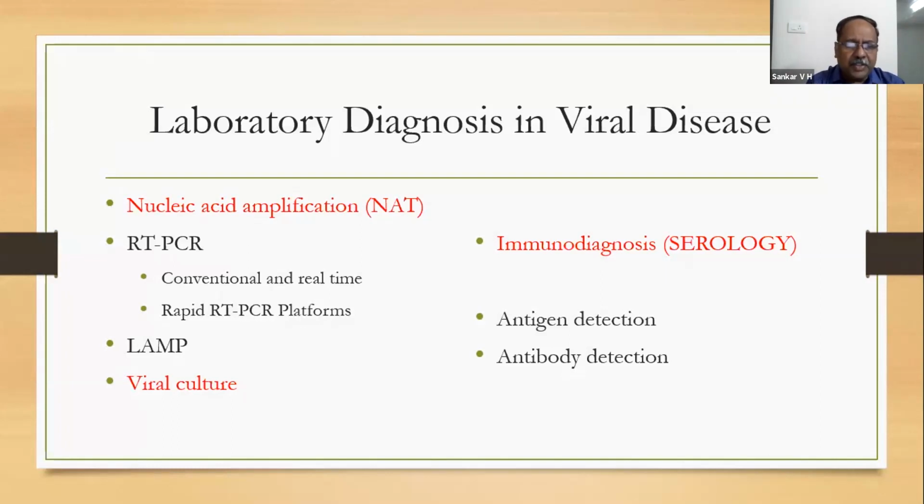And rapid RT PCR platforms will give the results in around 2 or 2.5 hours. I will come to that, with 1 or 2 examples. And there is a new technique, point of care testing, where no big machine is required. You can go to the field and do the test.